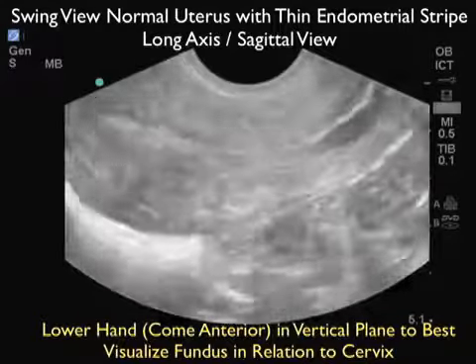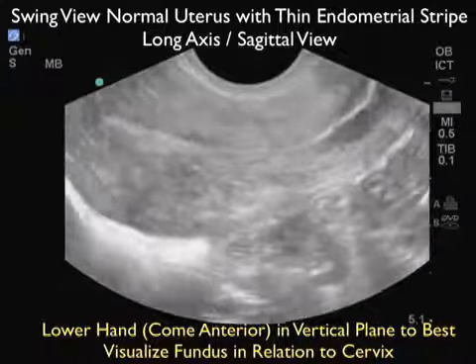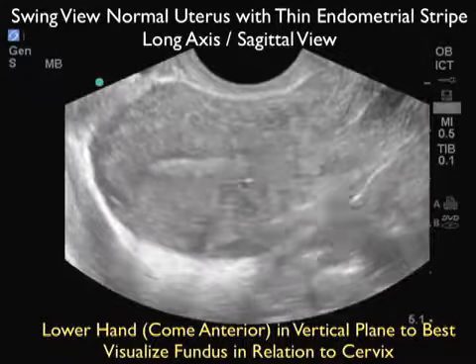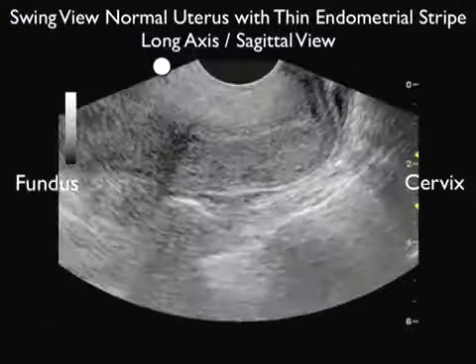So again, cervix, down to fundus, dropping my hand and orienting the probe more anteriorly so it's going to best image through the top part of the uterus. It's important to image all parts of the uterus as it can be difficult to get the whole uterus onto the ultrasound screen from one slice.